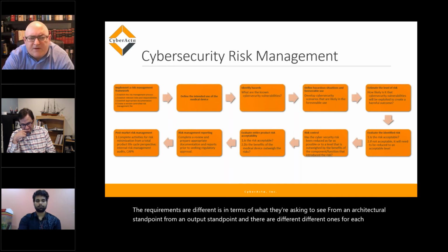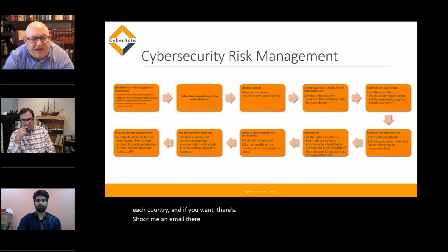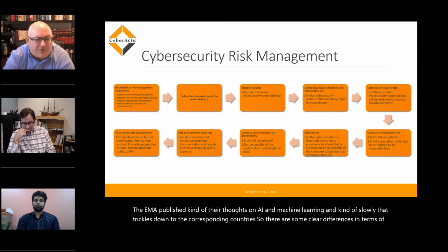If you want, shoot me an email. There are some clear expectations from the FDA. The EMA published their thoughts on AI and machine learning, and slowly that trickles down to the corresponding countries. So there are clear differences in what each region is expecting, but the process is the same.